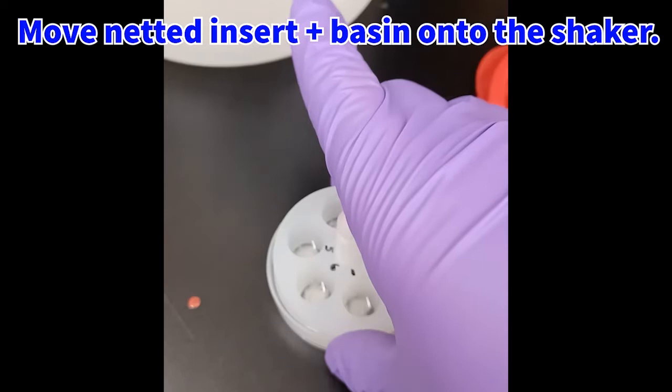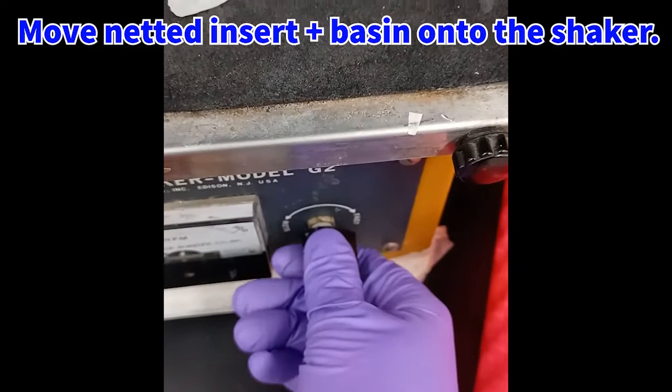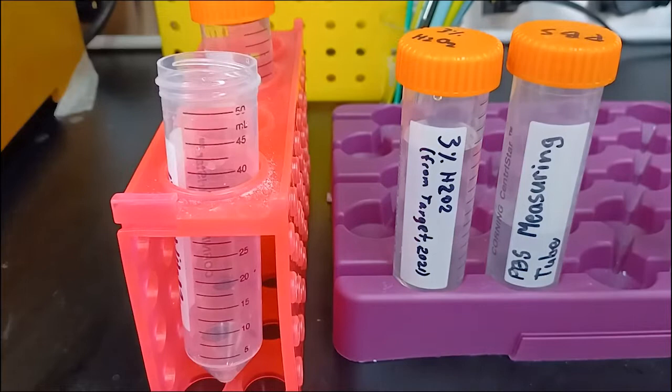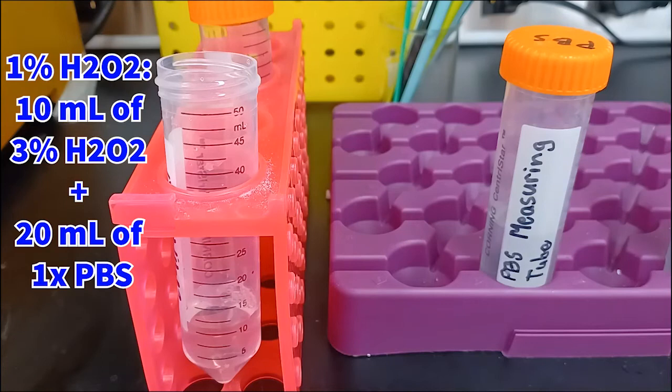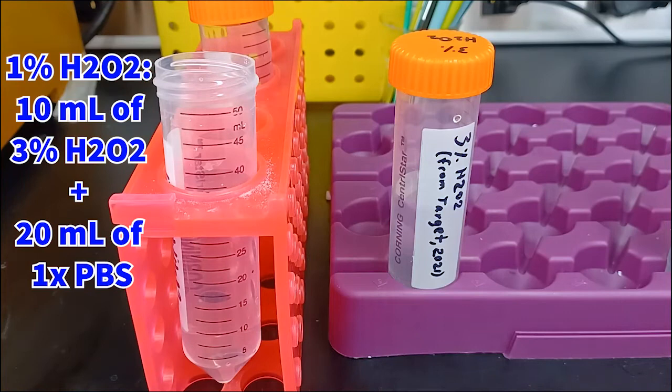Now migrate the netted insert plus basin onto your shaker in a container in order to prevent spillage. Set the speed to an appropriate speed that will cause the sections to shake and agitate without causing spillage out of the basin. Here we are making a slightly diluted hydrogen peroxide solution, using store-bought 3% hydrogen peroxide diluted in one part original solution and two parts 1x PBS — in this case, 10 mLs of the store-bought peroxide and 20 mLs of PBS.